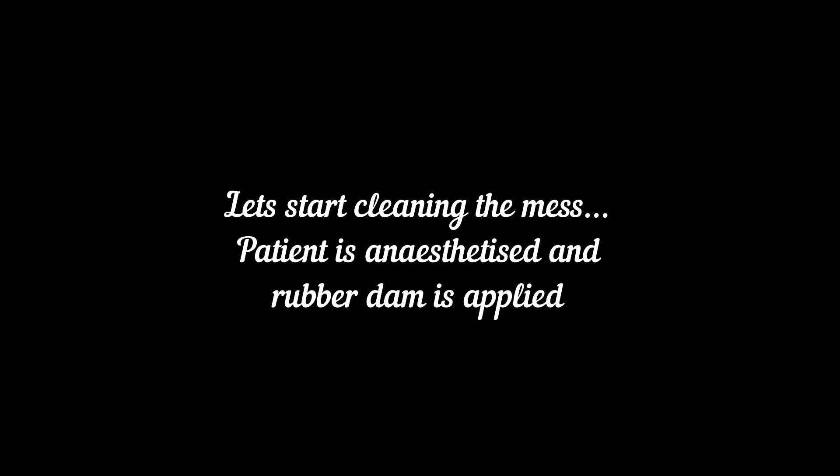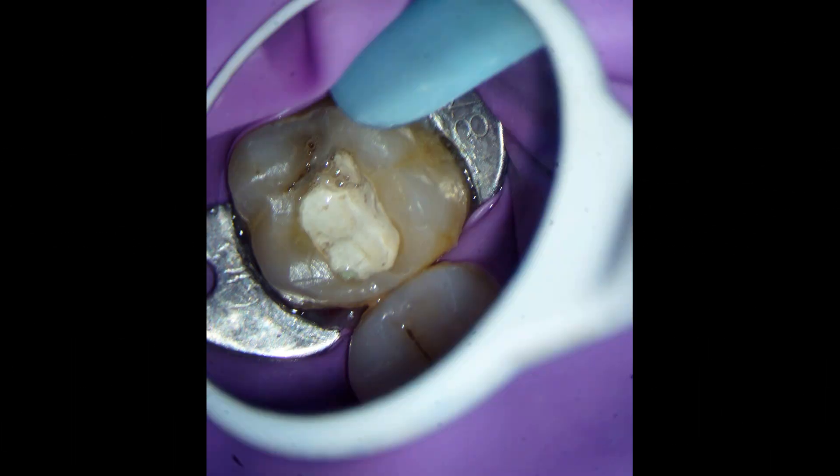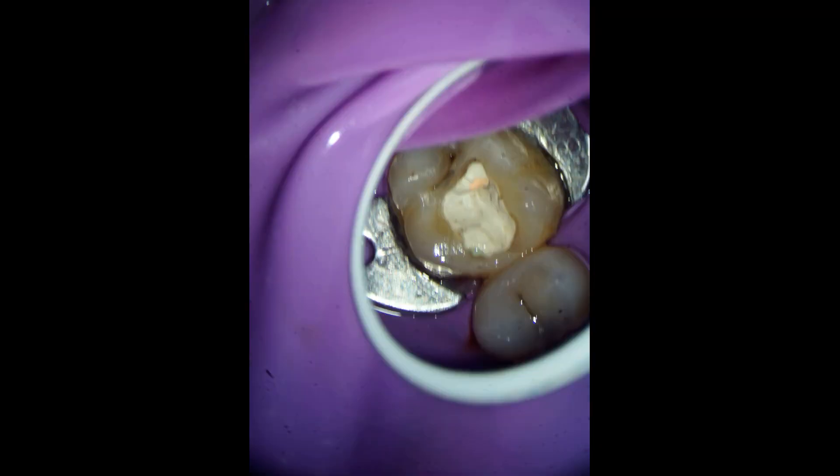Now let's begin with the retreat. As you can see, after the root canal, permanent restoration has not been done. As soon as I remove a little bit of the temporary, we can see this whole mess.